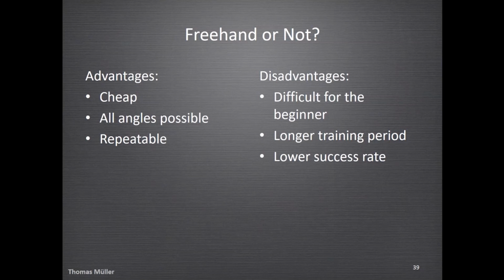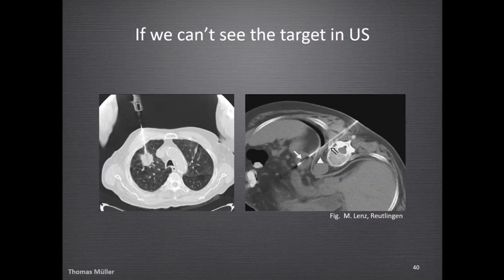So the learning curve is not steep. It's a flat learning curve. It takes you some time. Needs a longer training period. And in the beginning, it has a lower success rate, only in the beginning. So I would recommend to do freehand because it is very cheap and it allows you to get a good angle to almost every lesion you want to get.